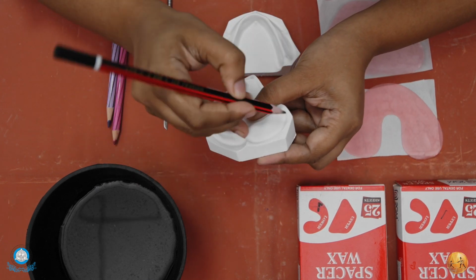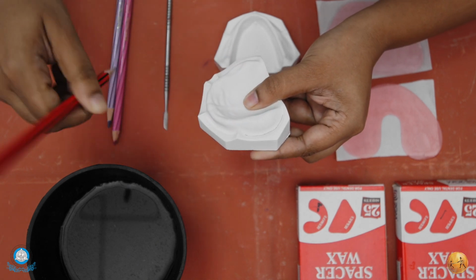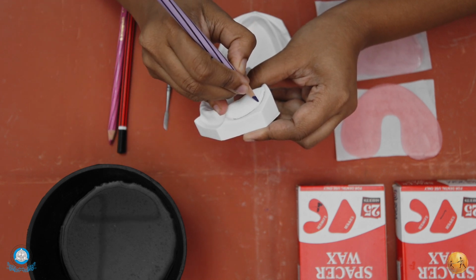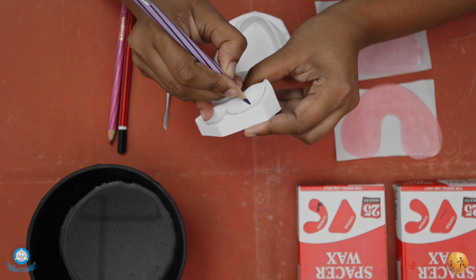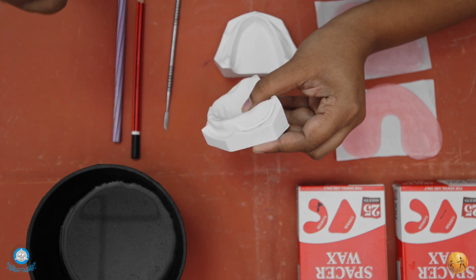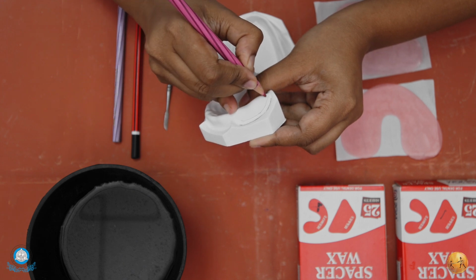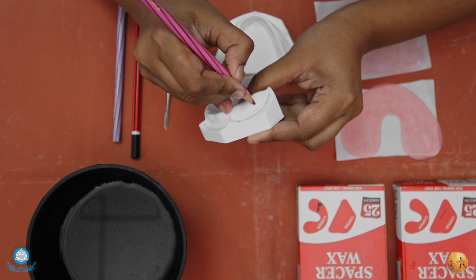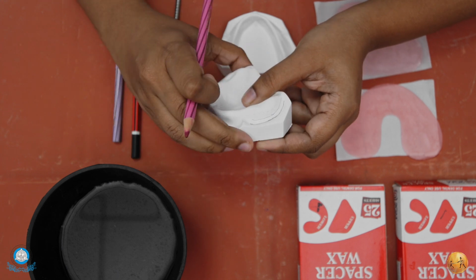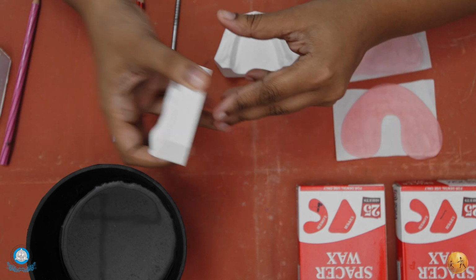First of all we are going to draw a sulcus line with the lead pencil. Above that, 2 mm above, will come the line for your tray. And 2 mm above that, that means a total of 4 mm from the sulcus, will come the dotted spacer line. You are supposed to follow these lines all over the boundaries of the cast. After drawing the lines, the cast is going to look like this.